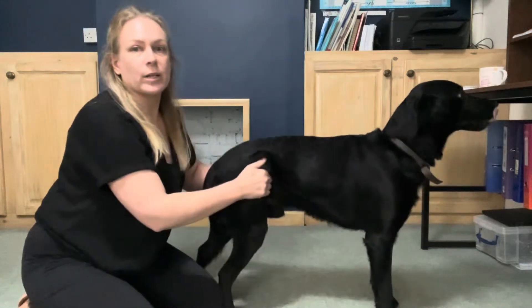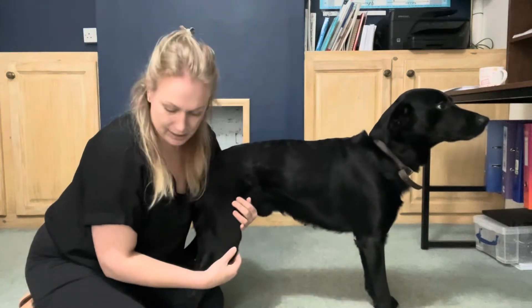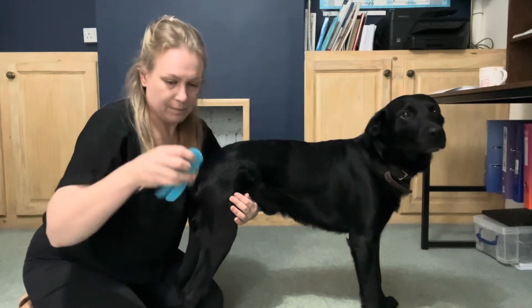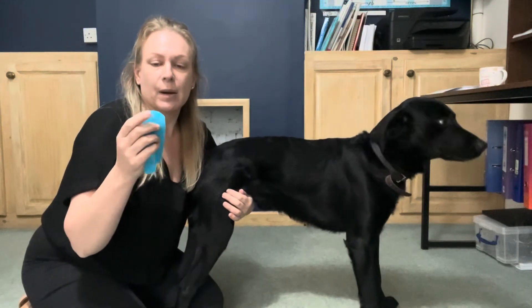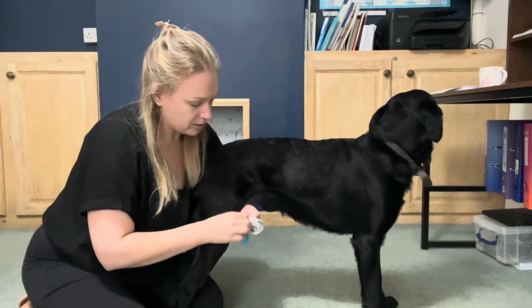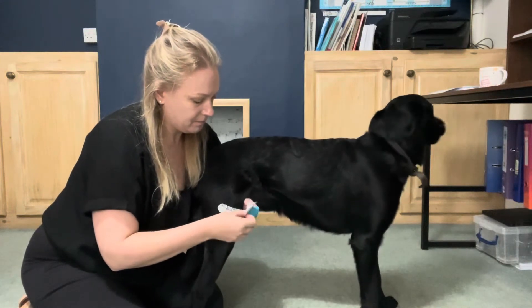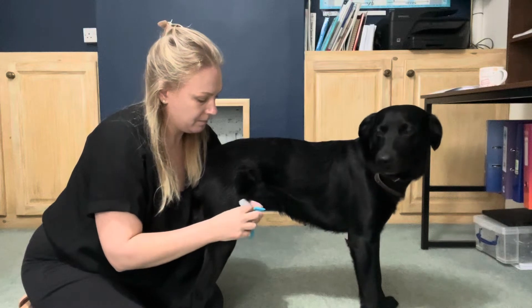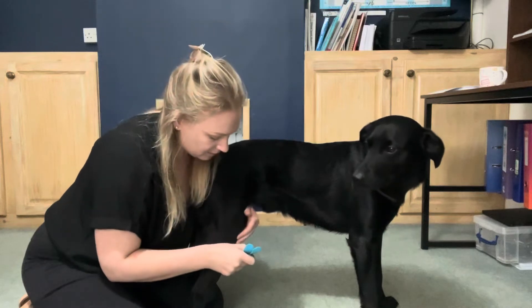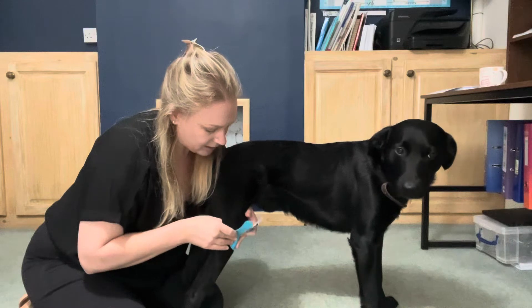With your dog in standing, locate the patella and apply your Y strip first. The anchor part is the whole section at the top — remove the tape backing from this section and apply it just under your patella, over the patella tendon, without any tension.